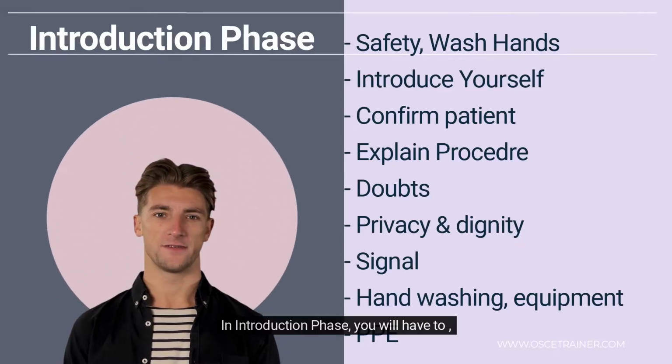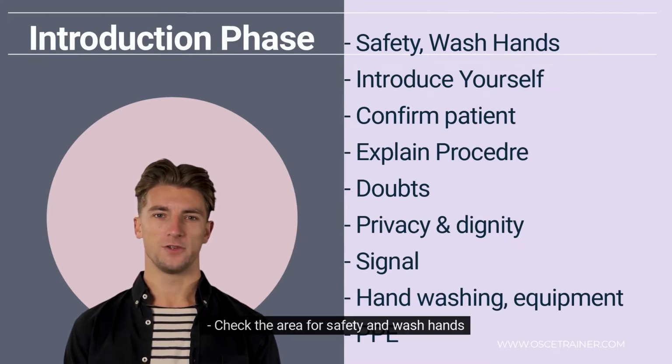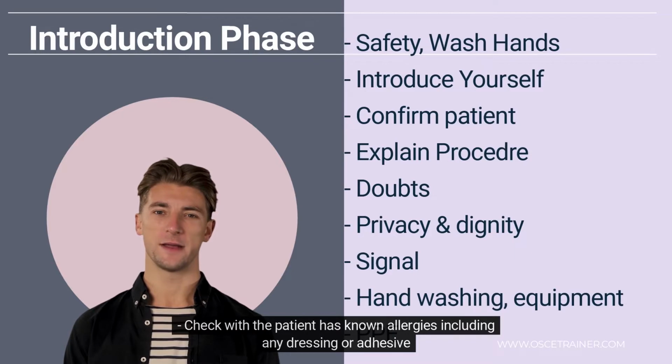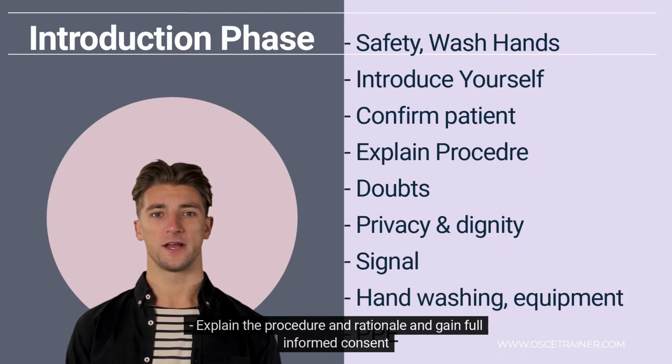In introduction phase, you will have to check the area for safety and wash hands. Introduce giving your name and role. Confirm identity of patient and what they would like to be called. Check whether the patient has known allergies, including any dressing or adhesive. Explain the procedure and rationale, and gain full informed consent.